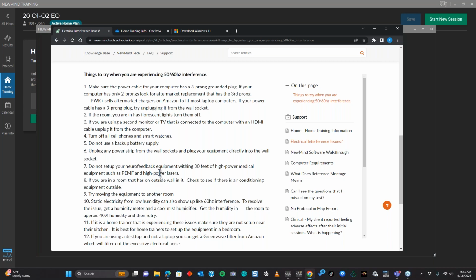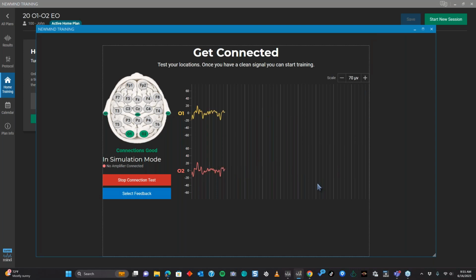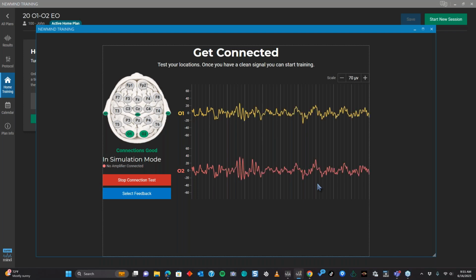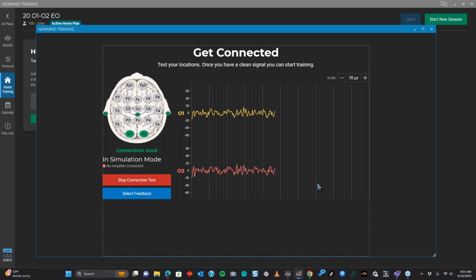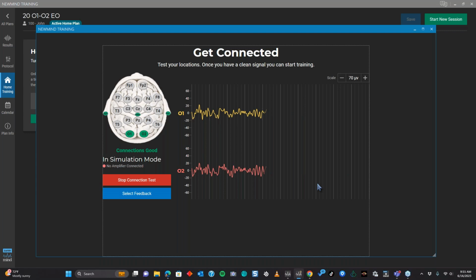So you can try that with your client. If you watch them put their sensors on through a Zoom call, and you're saying, yeah, sensors look fine, nothing wrong there, then this is probably the issue: electrical interference. Maybe they're set up near the kitchen with a bunch of appliances, or they're near the breaker panel, or the computer they have isn't grounded right. So this will explain everything. And again, I'll put this link up when I post these last two videos.